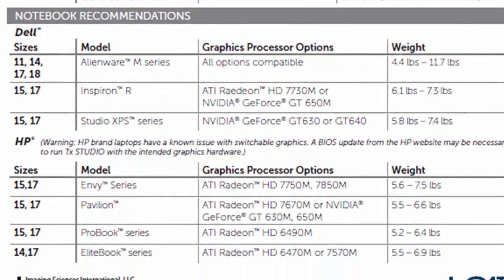While not an exhaustive list, shown are recommended notebook computers. While a computer with a 14-inch screen seems more manageable than one with a 17-inch screen, consider the use of the computer. For example, will you be sharing your screen with patients during consultations, or will you be doing a lot of your case planning on the notebook? Eyes get tired quicker when looking at a small screen.